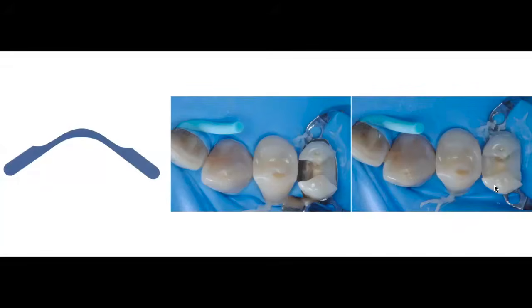But again, this is a good option, but it limits your clinical applications because I have had issues. If you use the ones that I use, which are not retainerless, you have the weight of the band retainer, that can move this little band or not allow the band to fully sit around the margins. Now you can correct that by using a wedge. But the wedge can also alter or modify the shape of your band. So again, there are a lot of questions and answers that need to be asked. And that's why my goal today is to present a way of obtaining this same type of result using a little bit of a different clinical approach.